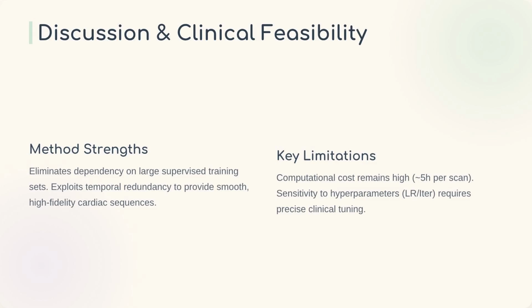To conclude, TD-DIP is a promising unsupervised method for dynamic MRI reconstruction. It can produce high-quality cardiac images without pretrained data and can reduce undersampling artifacts effectively. But for clinical use, the method still needs faster optimization, better early stopping, and more testing on realistic clinical data.